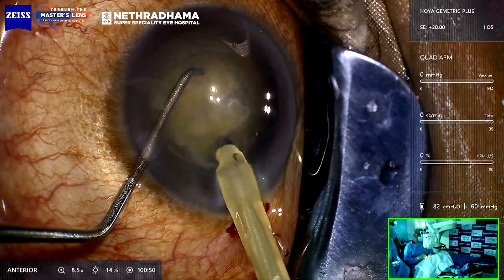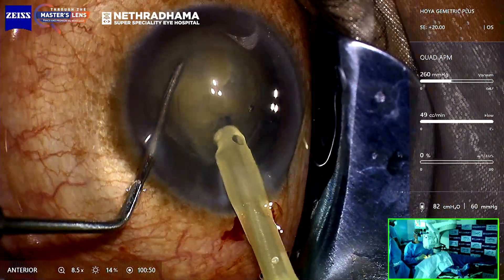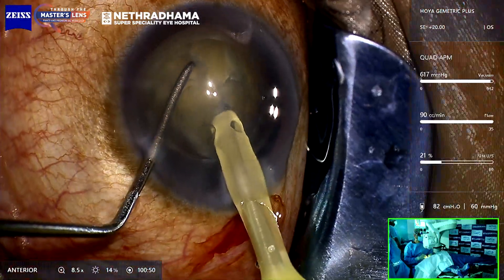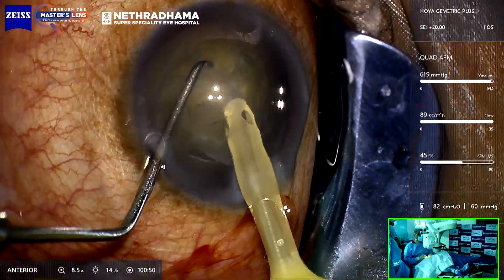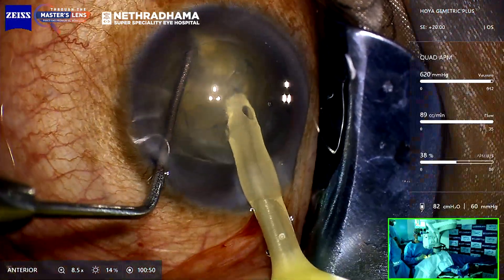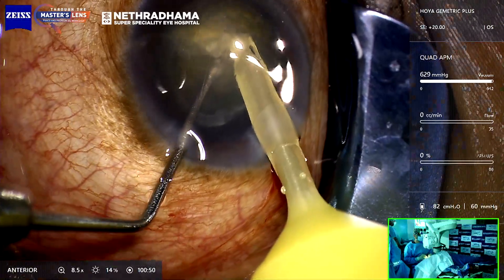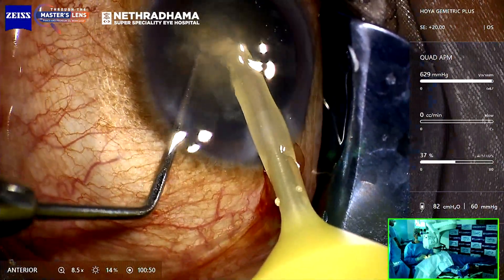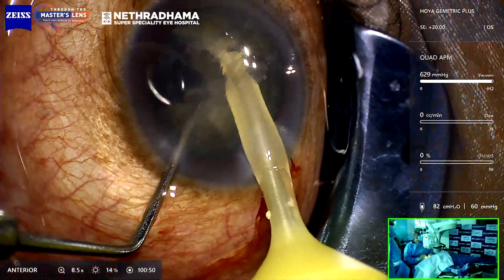You start at the edge of the rhexis. I'm using the APM quad here — bury sufficiently, then hold the vacuum and bring the tip towards the center. It's a denser cataract. You can see you can do sequential burying, and then you have to split the nucleus.